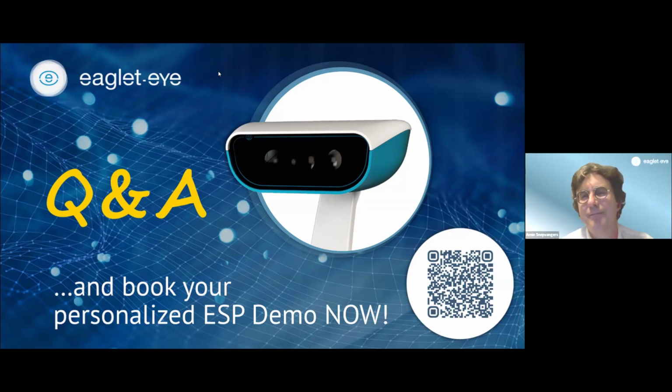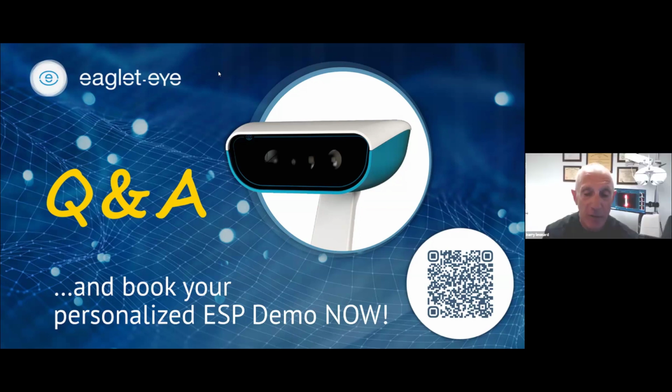I hope, by that, we try to tell them at least give me 3 days, and you still see something on the sclera. I mean, when do you not see it? How long would it take? It depends how that lens was fit and how hard it was smashing down on that sclera, and maybe how soft that sclera. We don't have a way to measure sponginess of a sclera yet, but we try to just tell them at least give me 3 days, and we've been doing well with that.